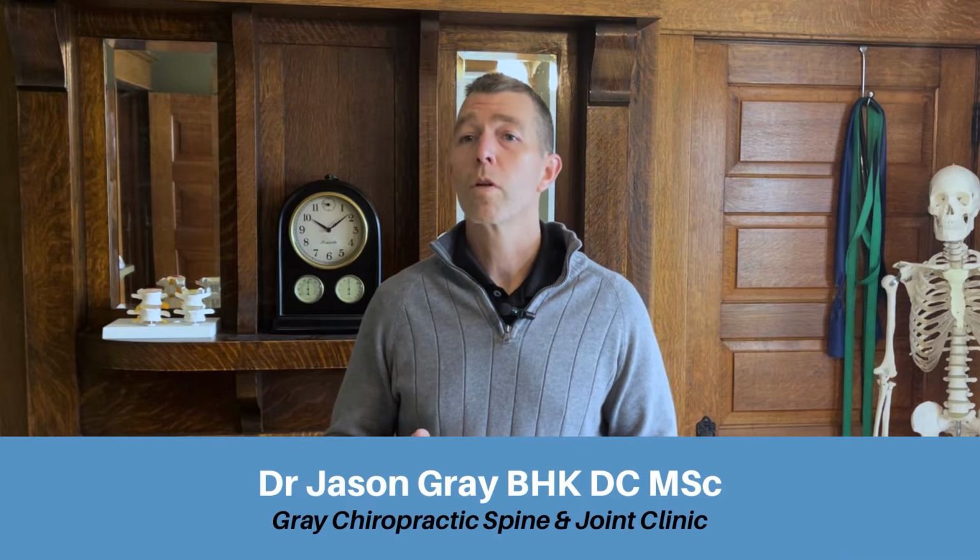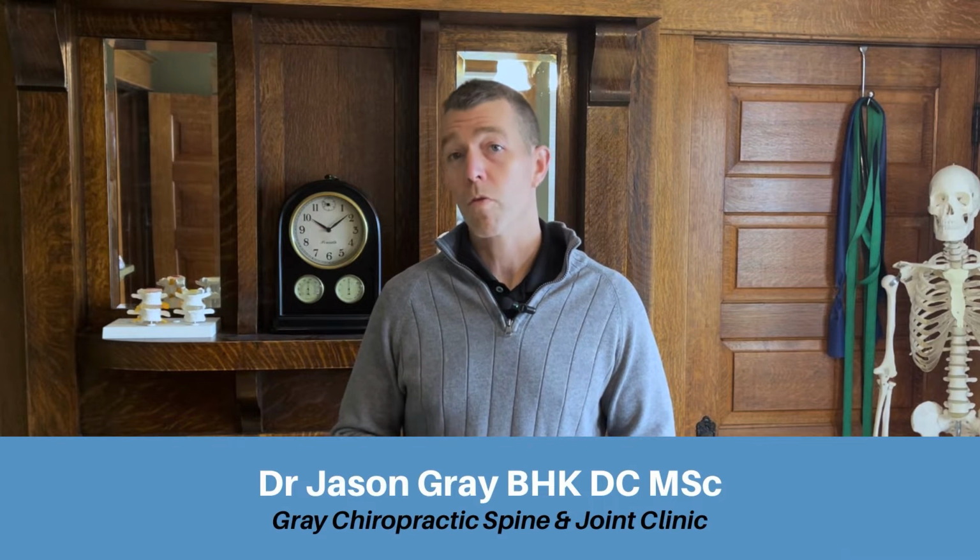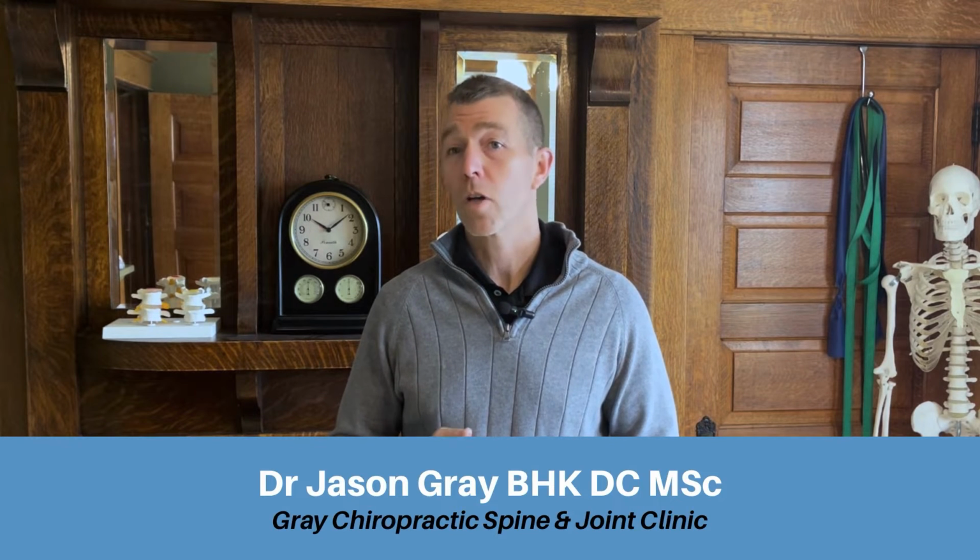Hi, I'm Dr. Jason Gray, and here in this video we're going to review the general procedures for performing a lower back treatment known as Cox Flexion-Distraction technique, which is one of the unique treatments that we perform in our office when treating both acute and chronic low back pain, as well as with treating sciatica pain.